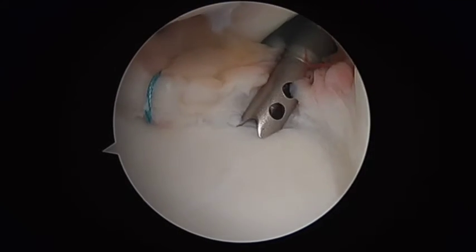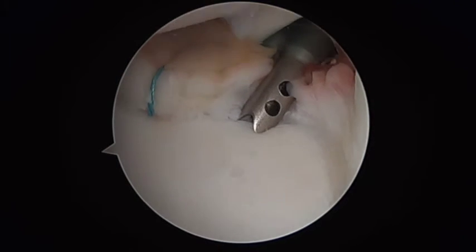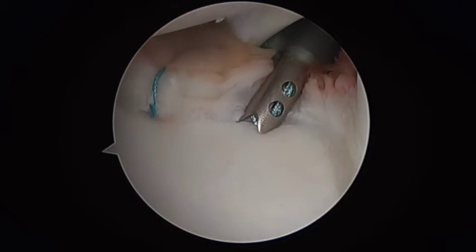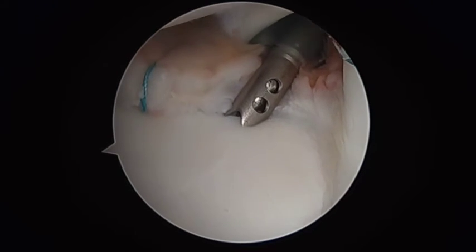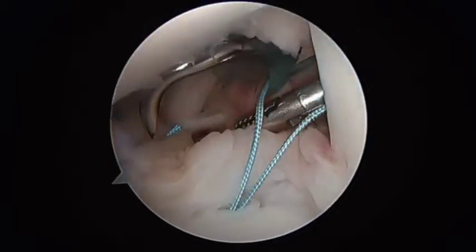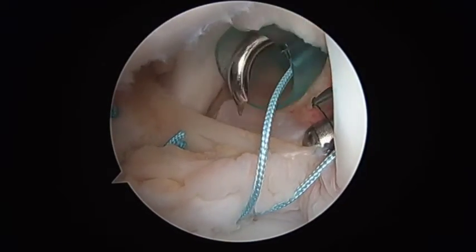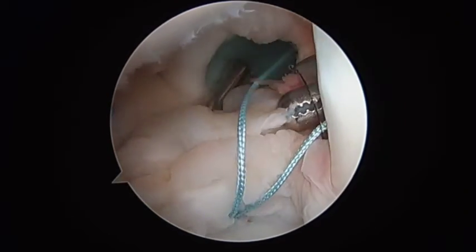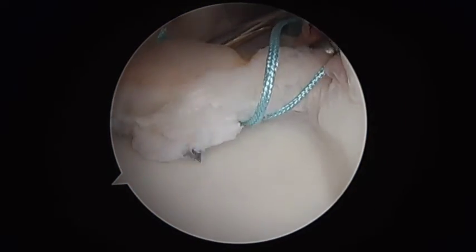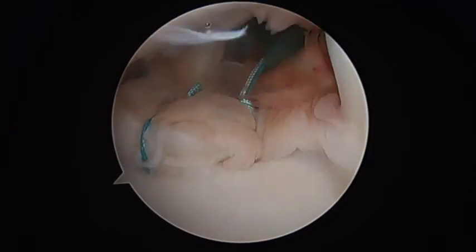The arm was taken down and a repeat examination under anesthesia was performed. The shoulder was now stable to load and shift testing in all directions, including anterior, superior, anterior middle, anterior inferior, and posteriorly. Note that as the final anchors are being placed superiorly on the glenoid, the middle glenohumeral ligament is nicely retensioned to provide stability to the joint.